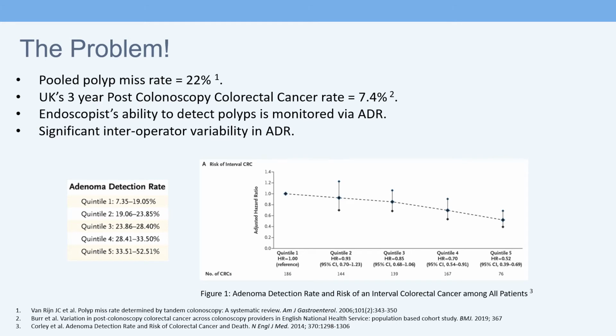So let's start with endoscopy and colonoscopy. What is the problem at the moment? Well, the problems are that we have, firstly, polyps that are often missed, so our adenoma detection rate may be low, and therefore cancers may be missed. And if we then look at the second problem, if we have polyps that are missed, are those polyps that we're seeing cancerous polyps, or are they hyperplastic polyps that can be ignored? So this is where we start from.